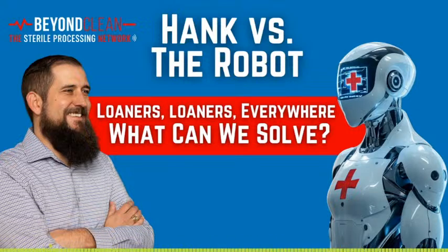First, internal specialization within SPD. Departments could create dedicated loaner teams or rotations. For example, rather than spreading loaner reprocessing across all techs, assign a subset who are specifically trained and consistently handle loaner trays. This could reduce errors and build expertise while giving newer techs a clear growth path. You'd still need cross-training to cover vacations or sick days, but the primary responsibility would sit with the specialists.